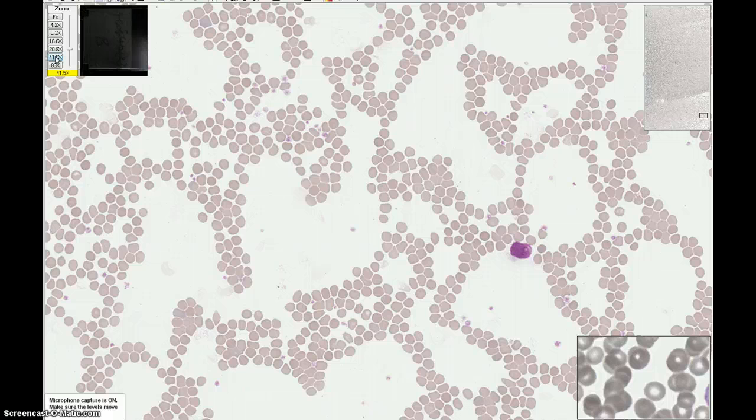In a wedge or bullet-shaped smear, the area towards the tail end is too thin. You'll notice that the red cells are arranged in a cobblestone pattern, the red cells have no area of central pallor, and they take on a distorted shape — not the typical circular or round shape you'd expect red cells to look like.